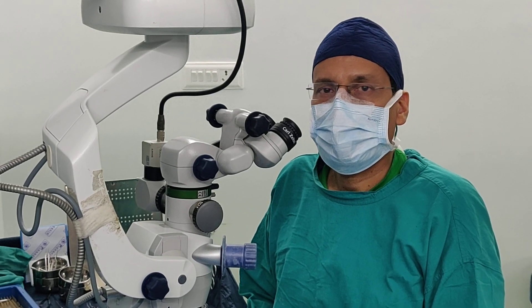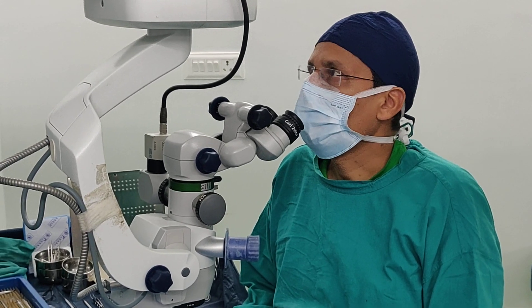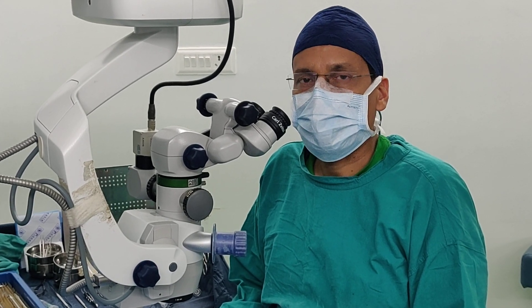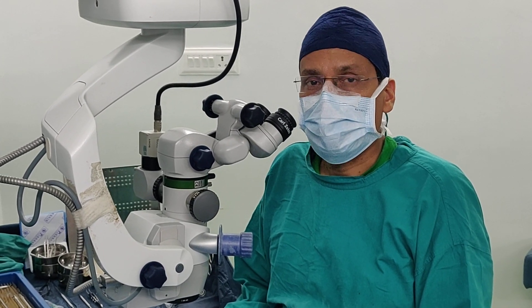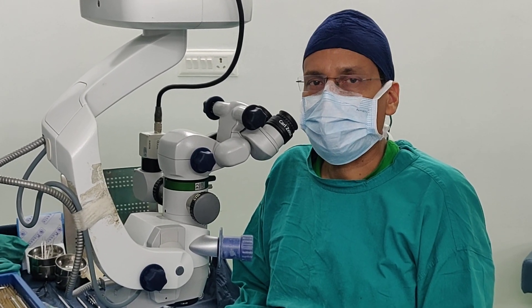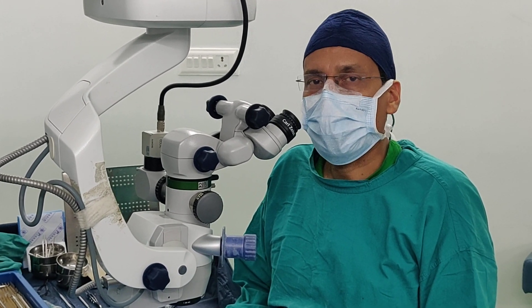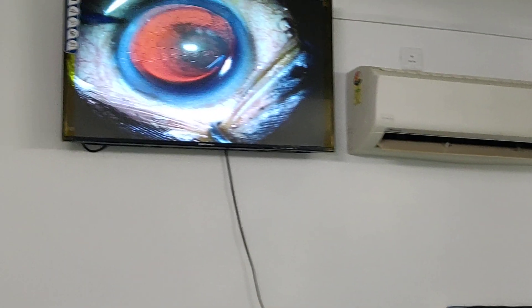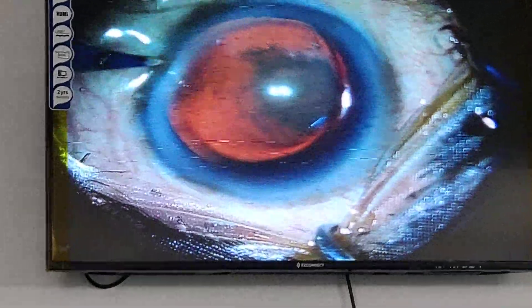Hello friends, I am Dr. Suresh Pante and today I am going to show you cataract surgery with implantation of Lucidus EDOF lens manufactured by Swiss Advanced Vision. The first step is the side port incision, and this is the side port incision you can see here.